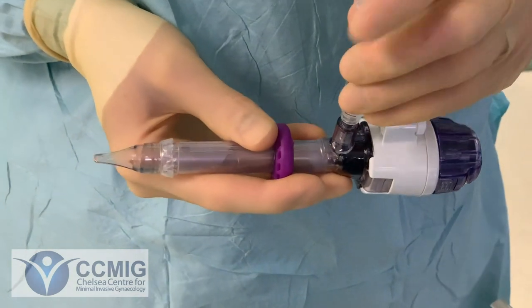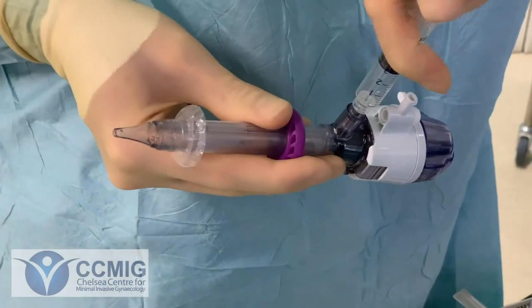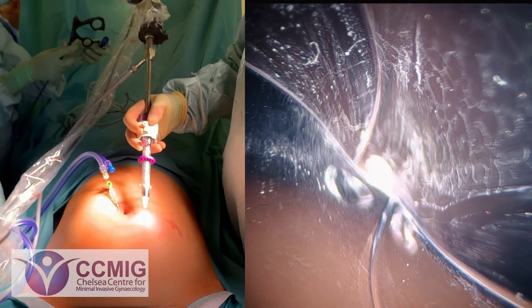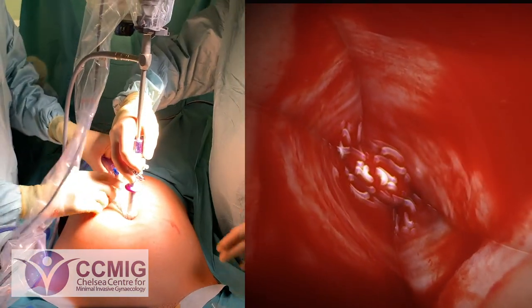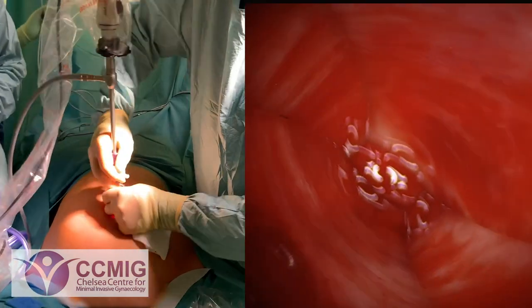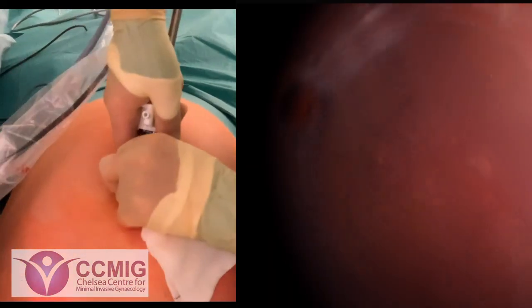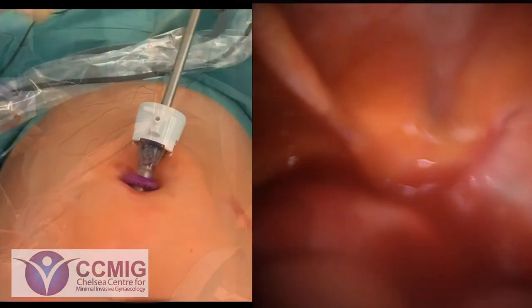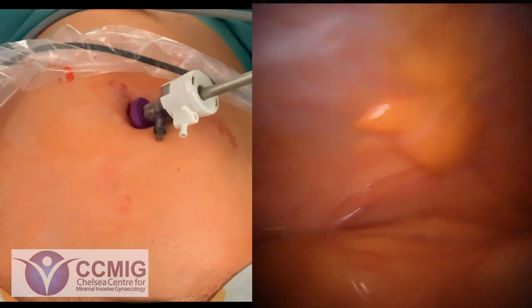This balloon being inserted allows us to provide a good seal with the peritoneal cavity so we don't leak any gas. So here we go entering into the abdomen. You can see the camera looking down the port now so we can see all the layers we need to go through to reduce the risk of any damage to anything like bladder or bowel. And we're in. First of all let's have a good look around inside the tummy and check there's no injury to anything on the way in — this one all looks good.